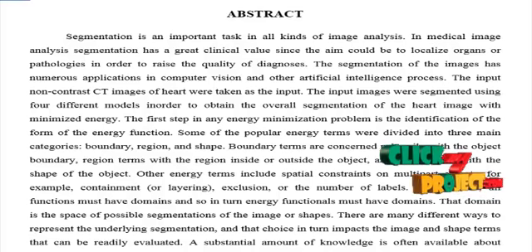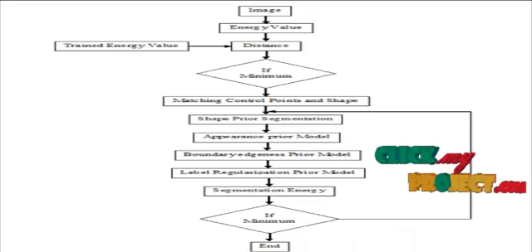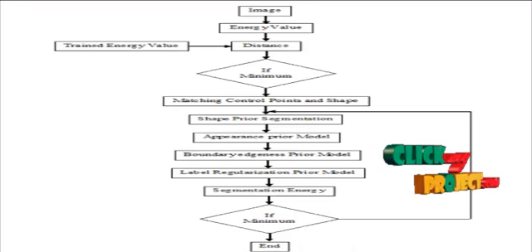The final segmentation energy is measured by a combination of the segmentation energies obtained in each segmentation case. The iterations were repeated so that the segmentation energy is minimized compared to the segmentation energy obtained in the previous iteration. Let us see the flow of the process.